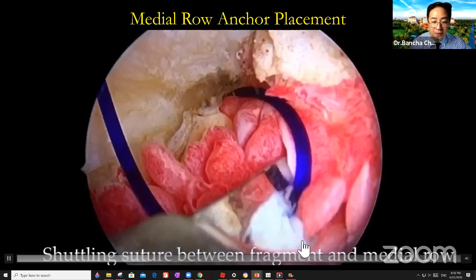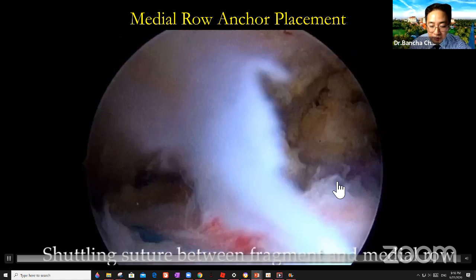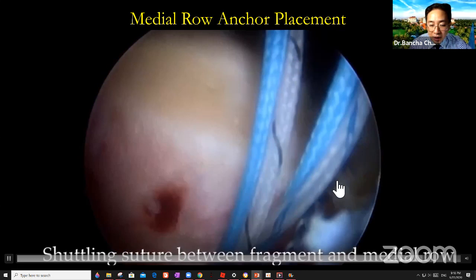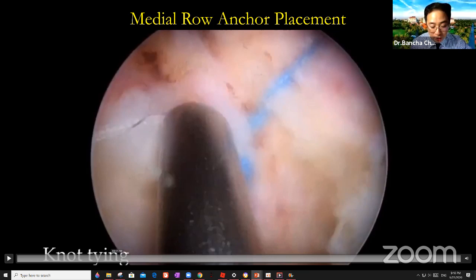And then I pass the suture using a shuttle into the cuff. That will be really easy because you make a shuttle to the tuberosity first. I put the suture shuttle first before I put the anchor, so the suture will not obstruct your view. If you put the suture anchor first, there will be a lot of suture and you will be confused. That obstructs your view, so I prefer to put the shuttle first. And then after that, I put the medial row anchor.